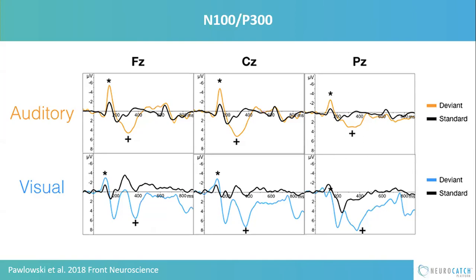If I ever have to worry about artifacts, alpha would be another example. If I'm looking at alpha, I can expect it to be larger in the CZ and PZ, and not as large in the front. So that's where the space information is also useful.